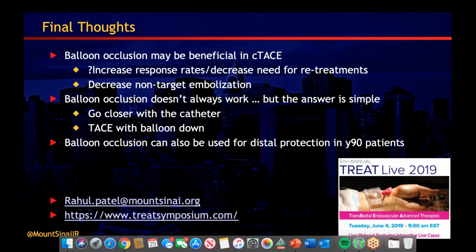Yeah, that's true. And until not so long ago, we didn't have an option for radial. Right. That was the other thing. So now we have a 150 balloon occlusion catheter, so that's also very helpful. Very helpful. Even for your prostate as well. Yeah, very much so. All right.